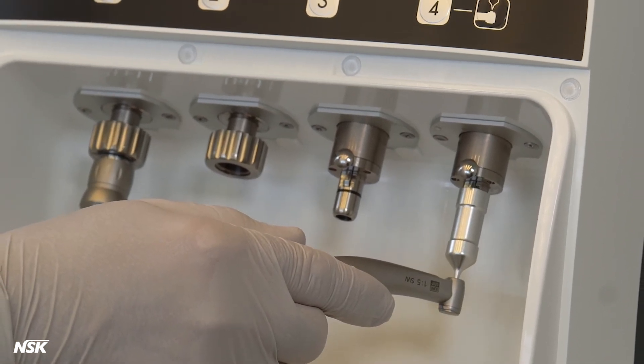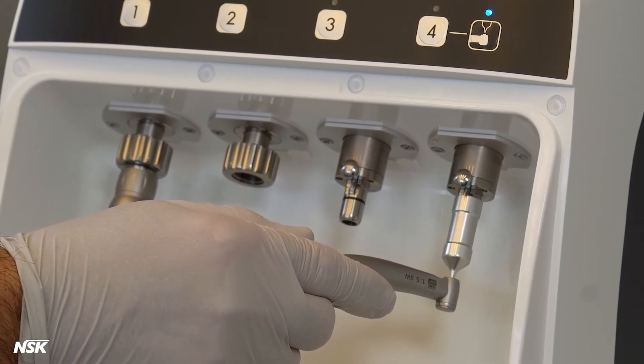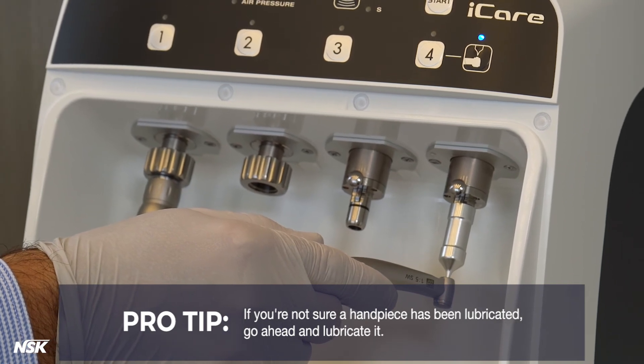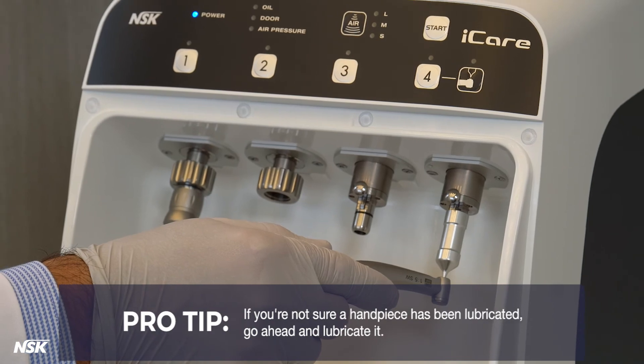However, main lubrication of the handpiece should be performed after each use and before autoclaving. Pro tip: it's not possible to over-lubricate with Eye Care. If you're not sure if a handpiece has been lubricated, go ahead and lubricate it.